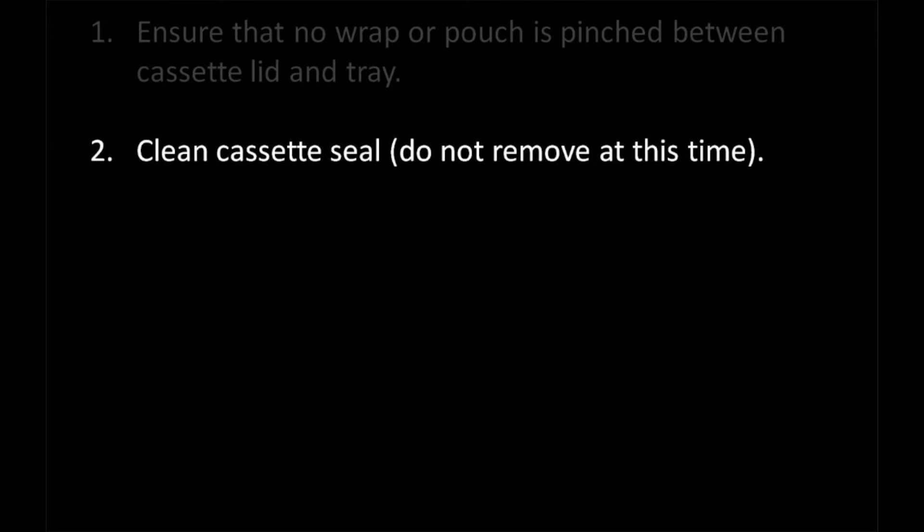According to the maintenance manual, you need to clean the cassette seal at least once a week. Without taking out the cassette seal, wash the seal with a mild soap and water to remove any white mineral deposits or debris that may be on the seal.